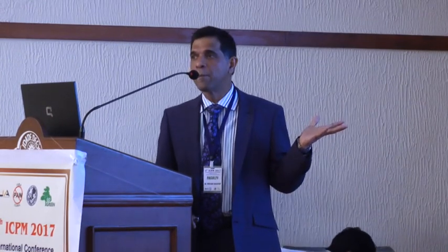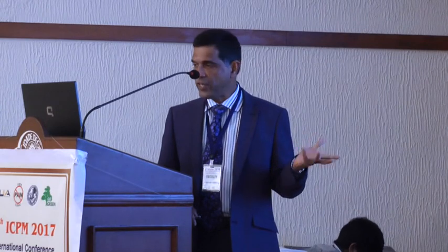Right, so when you're scanning, to make sure that you have the best image, you do some maneuvers with the probe to get the best view. One of the maneuvers that is suggested goes with the mnemonic PART. P stands for pressure, A stands for sliding, called alignment by some people, R for rotation, and T for tilt. With changing the pressure, the image sometimes becomes better or less good.